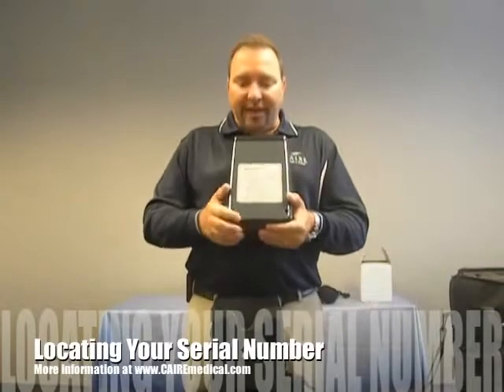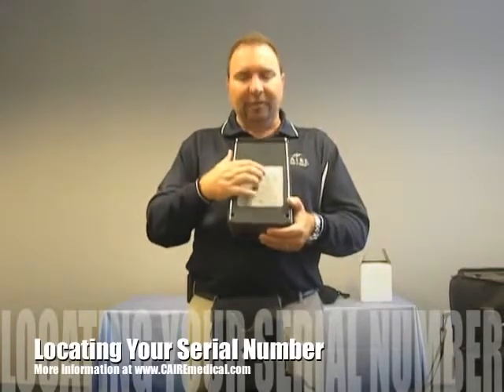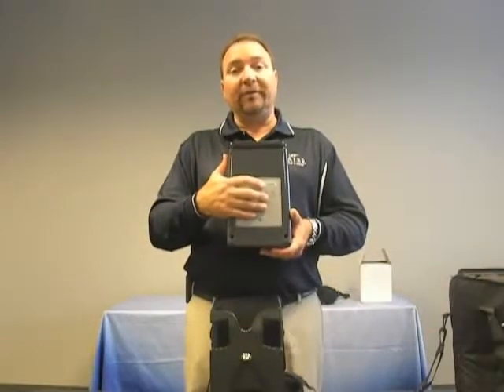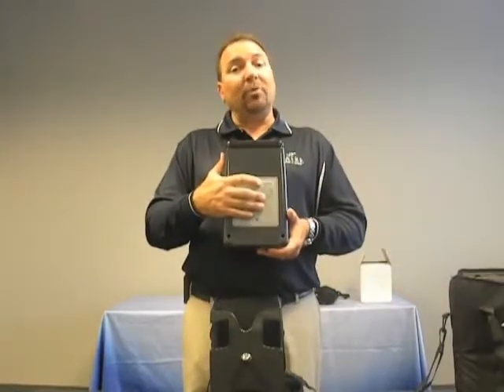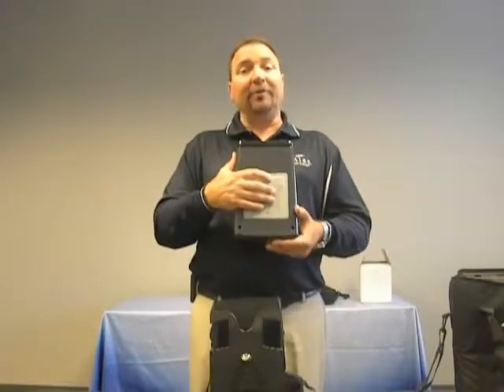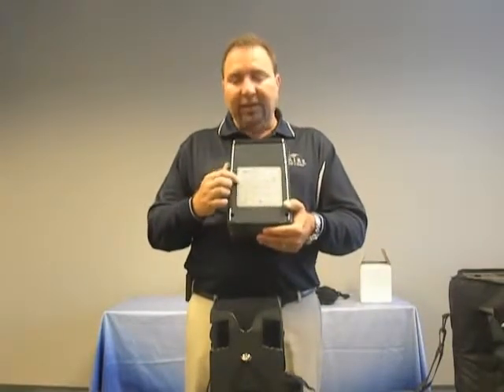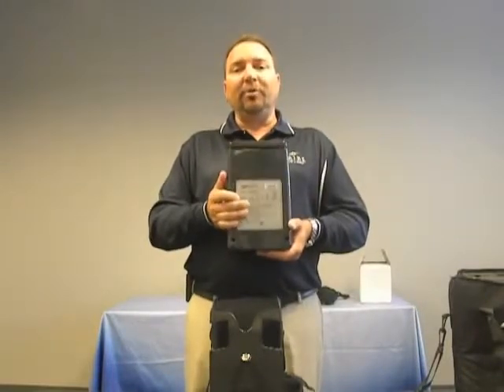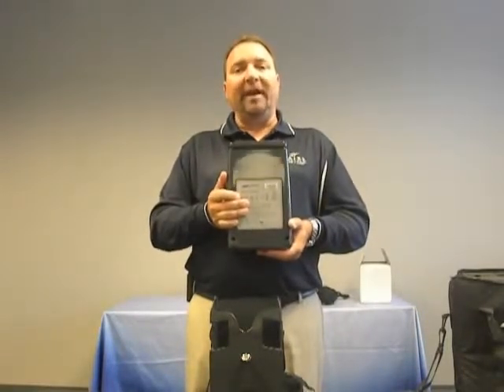Turning the FreeStyle 5 around, you will see a back label that includes a serial number, which is important to remember in the event that you need service. This serial number will always be requested by the provider who offered the FreeStyle 5 directly to you. In addition, there is labeling that indicates the FreeStyle 5 is approved for use on board aircraft and FAA approved.